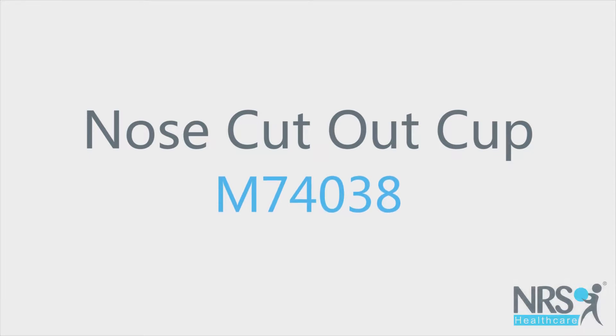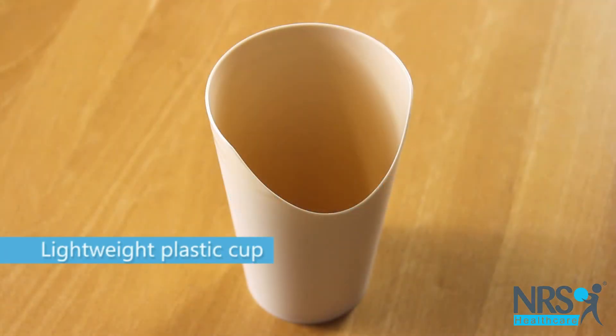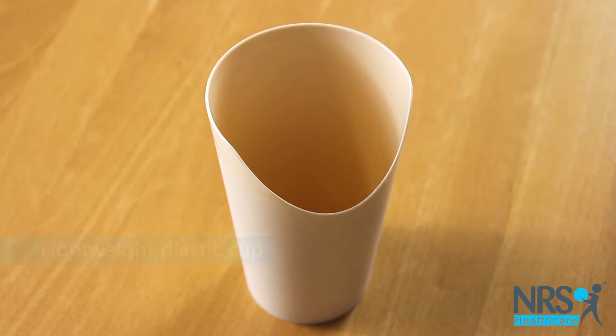Nose cut-out cup. This lightweight plastic cup may be easier to use than a standard drinking glass or cup.